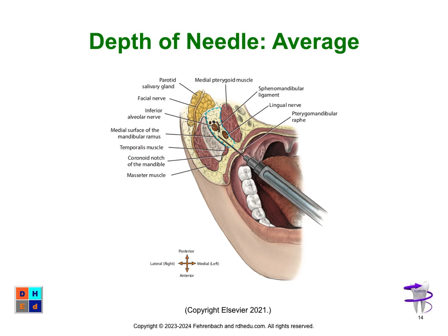So here's the needle, again, on a certain type of section here. We've got the lateral or right side, medial or left side, posterior and anterior. I've added those because sometimes when I look at a figure, I go, where the heck is that? Again, there's that masseter muscle. Oh my goodness. There's the coronoid notch. Remember, that's that hard tissue one.